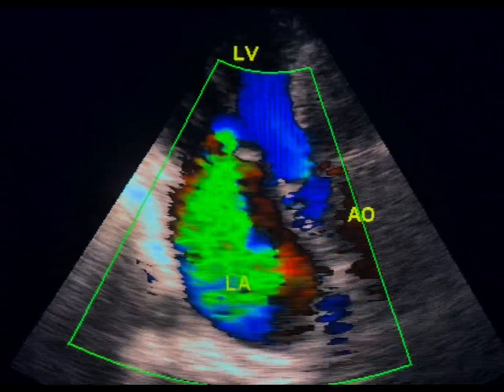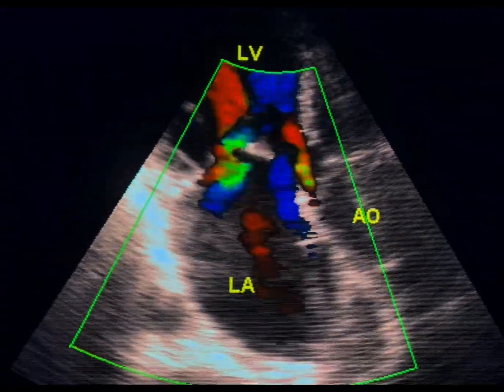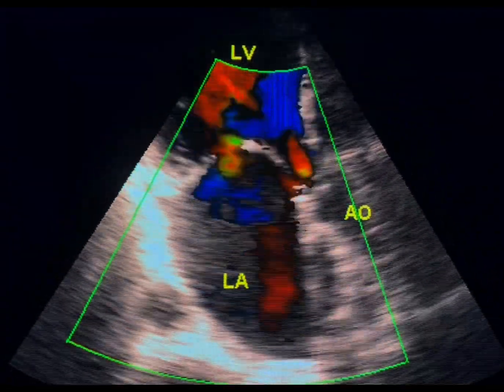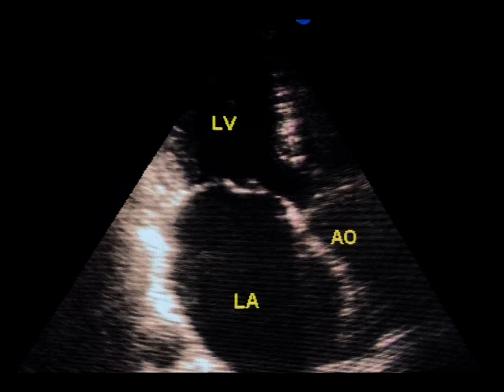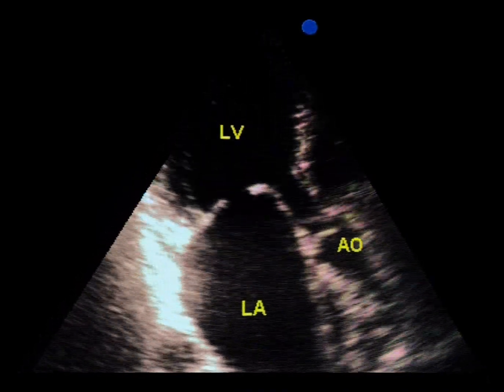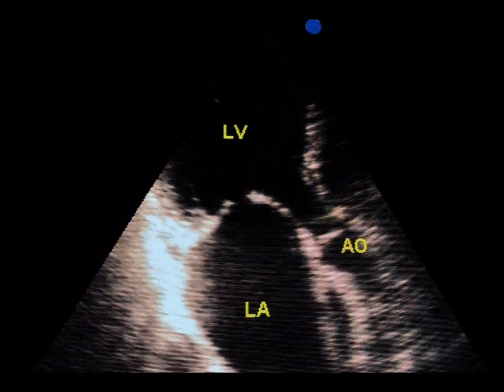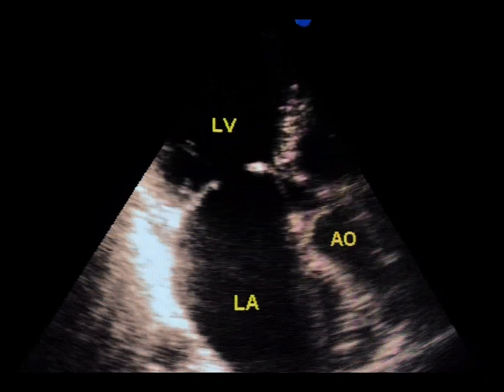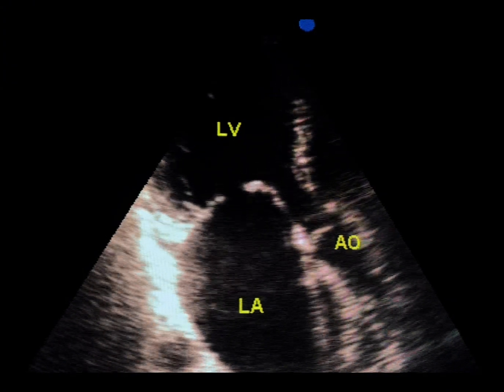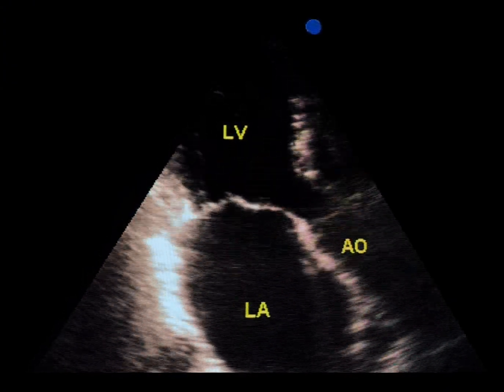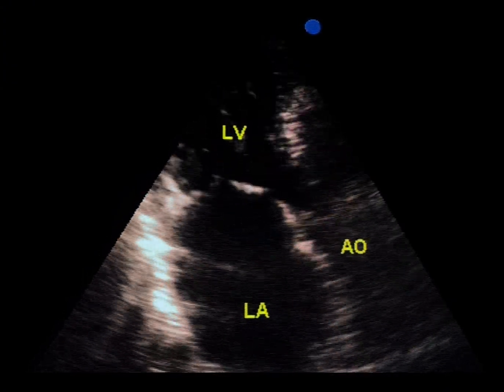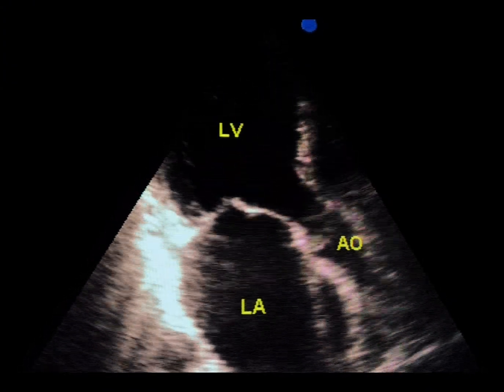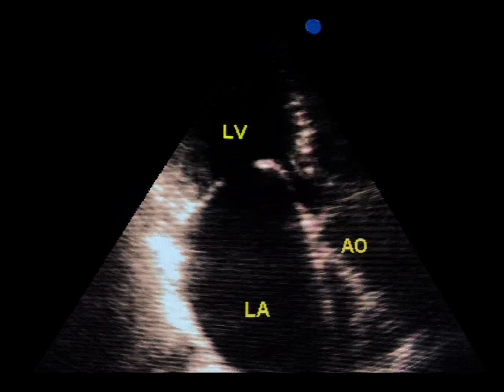Now let's look at this view of another patient with severe MR. Here, we see that the mitral valve leaflets are domed and exhibit restricted motion, which indicates primary mitral regurgitation due to rheumatic valve disease.